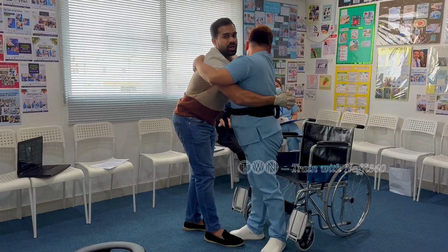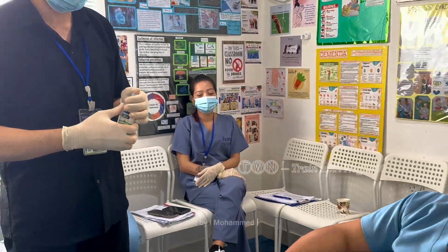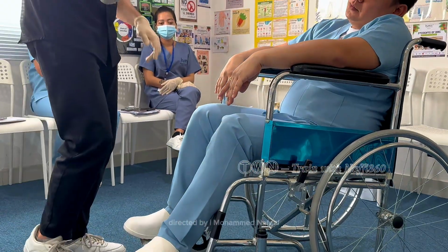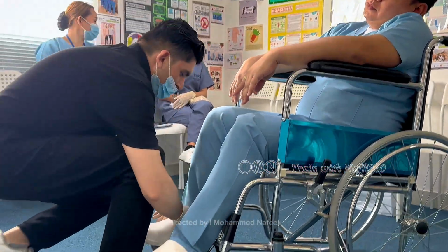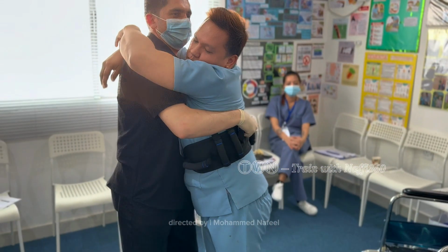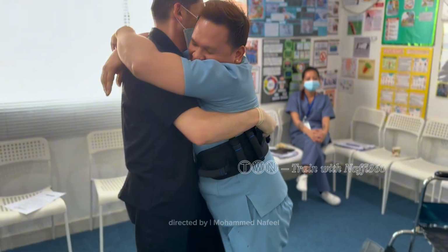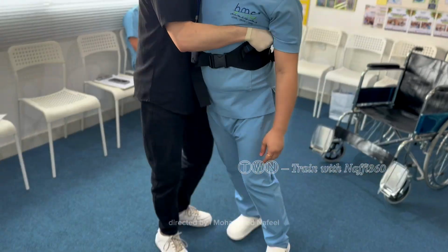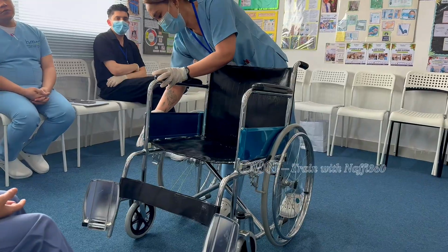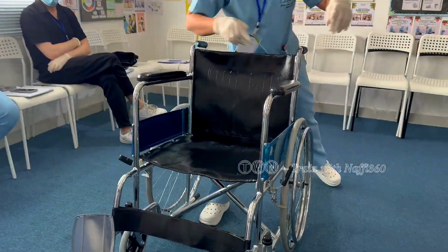Always observe the patient for balance and signs of fatigue, and adjust your support as needed. Safety and communication are the key throughout this process. After demonstrating this transfer, my students will now practice the technique under supervision. Each student will assist a patient from the wheelchair using the gait belt, ensuring proper posture, controlled movements, and patient communication. This hands-on practice helps to build confidence and skill in real-life scenarios.